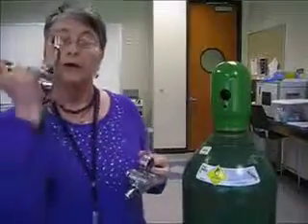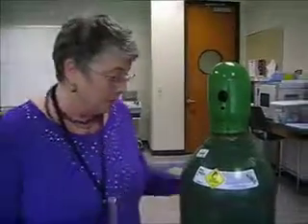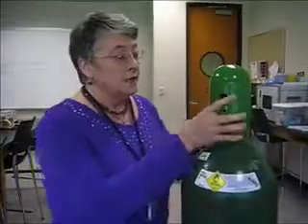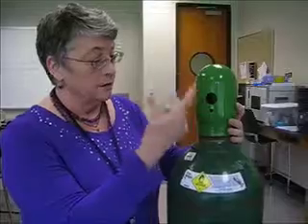This right here is a pin index safety system, and this goes to the little E cylinder. So I don't want this one. To put this on, I'm going to have to get a wrench, because I just don't have the strength in my hands. If this is a little tight, sometimes you have to tap it a little bit. You can't put oil on these threads, you're not supposed to put oil around this equipment. This is going to be kind of noisy.